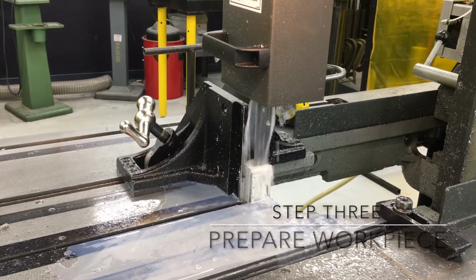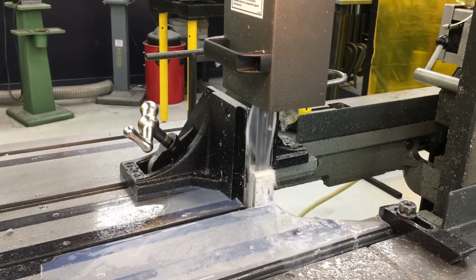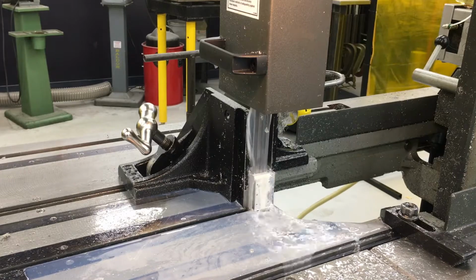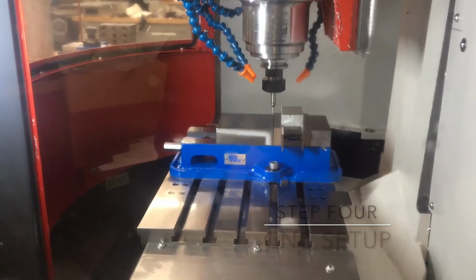Next, we will prepare the stock by creating a flat surface on the workpiece top using a bandsaw. For implants, you would typically use titanium or a titanium alloy, but for demonstration purposes, we will be using aluminum today. Next is the setup of the CNC machine.